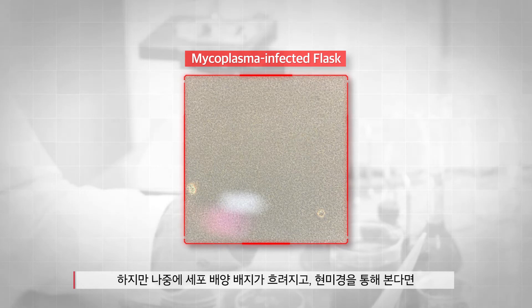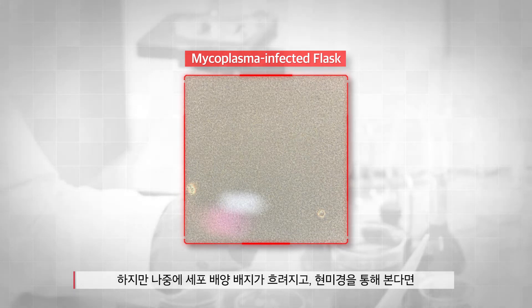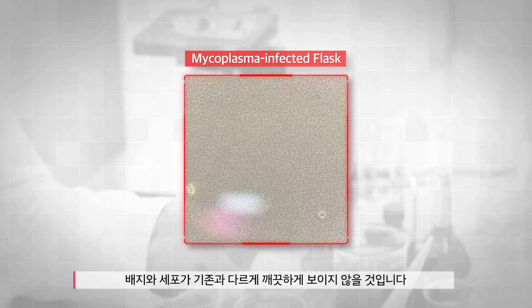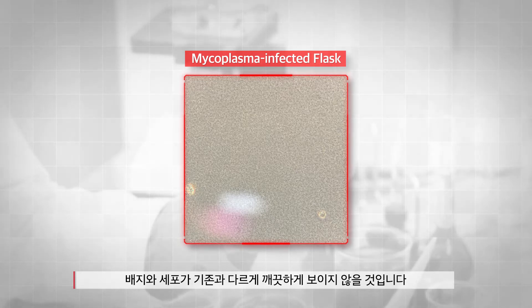Some mycoplasma is as small as 0.2 micrometer and can even pass through 0.22 micrometer filter pores. That is why mycoplasma contamination is so common. Due to the small size, mycoplasma contamination can be difficult to identify at early stages. Only later on, the cell culture media becomes cloudy, and when looking through the microscope the media and cells will not look as clean as usual.